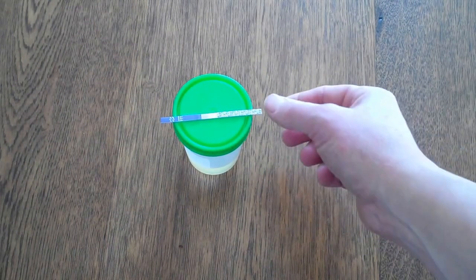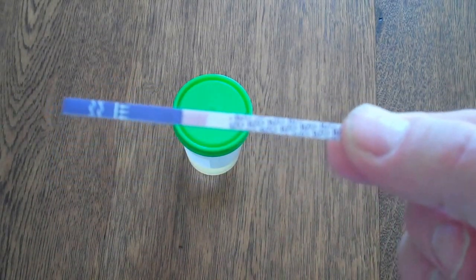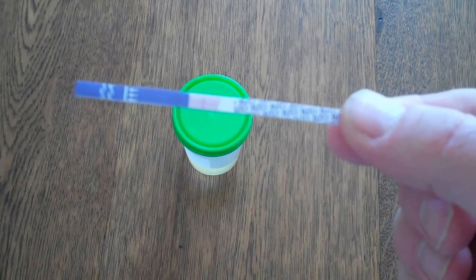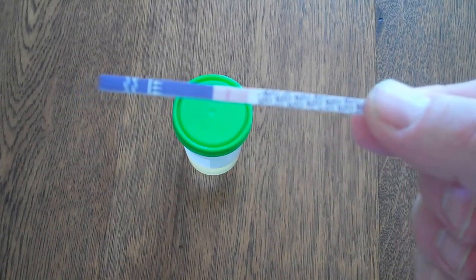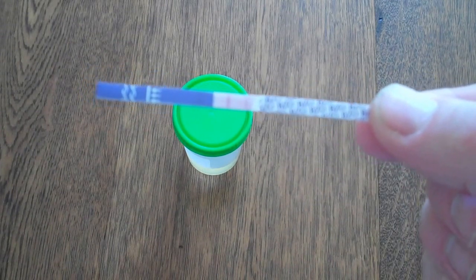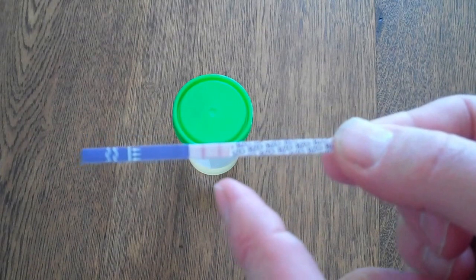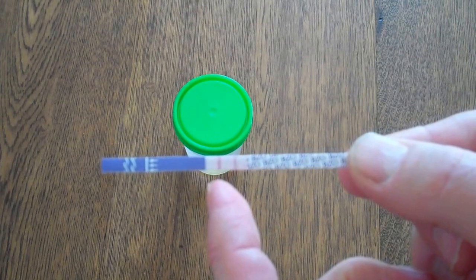And what you'll see, if I bring that close to the camera, is in the centre section of this test strip the pinkish dye osmotically being absorbed and travelling up through the test strip towards the handle end. And you'll see also developing in this test strip is a colour line developing at what will be the test line. It's just reached the area where the control line is going to form now. And what we'll see as this test clears is a control line forming, which is formed nearest to the handle end, and then nearer to the dip end you've got the test line.